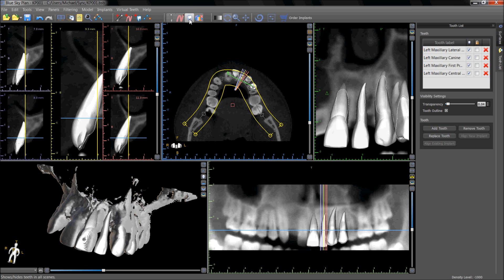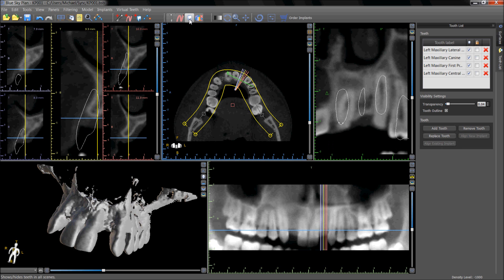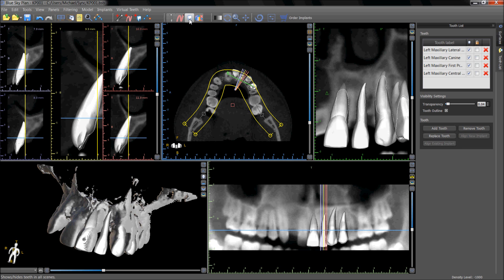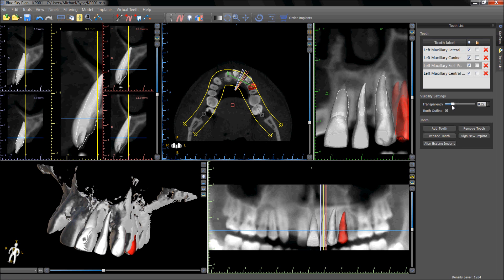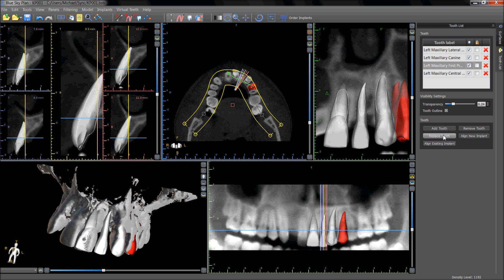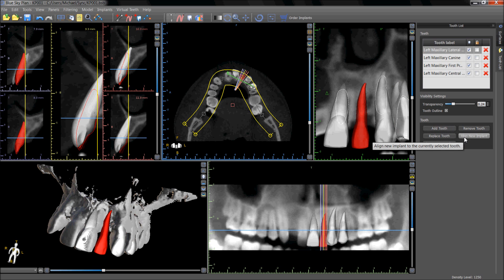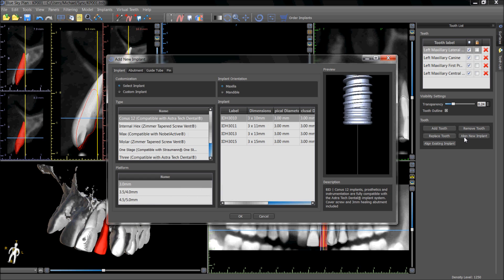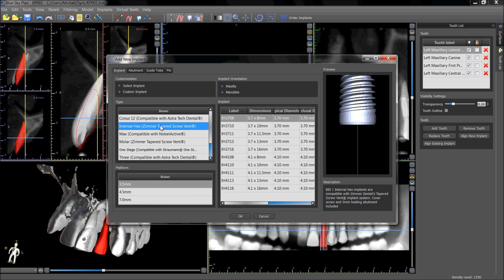The tooth icon on top can hide and unhide all the virtual teeth. The transparency of the teeth can be controlled via the transparency slider. Add tooth will bring up the tooth panel once again to add additional virtual teeth. Replace tooth will allow a tooth to be replaced with another tooth. Align new implant will align a new implant to support the selected virtual tooth.